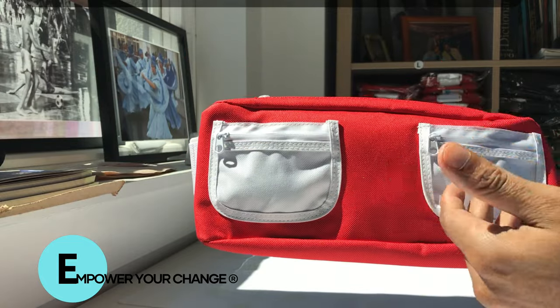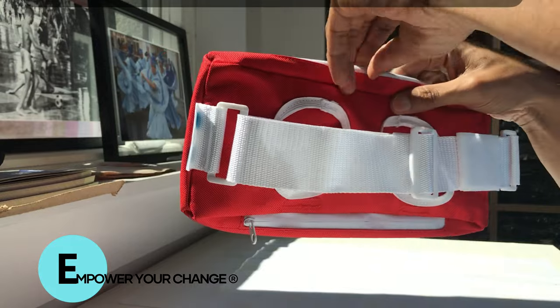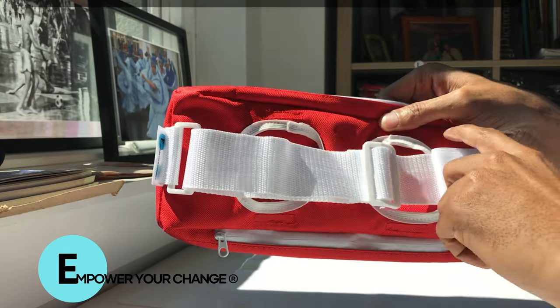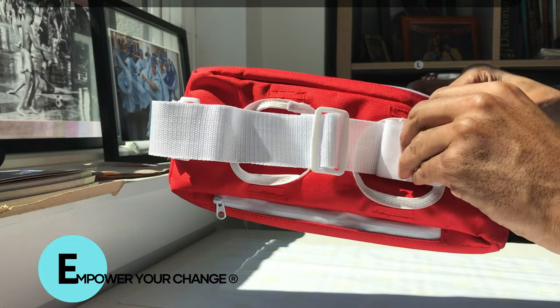You don't have to take a bulky wallet with you — you can put cash in if you need to. We also designed the belt to have a double security feature because we know once you go in the water you need that extra security.